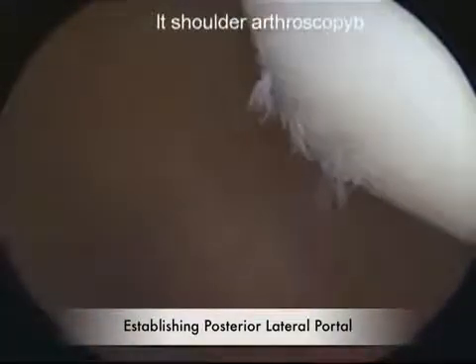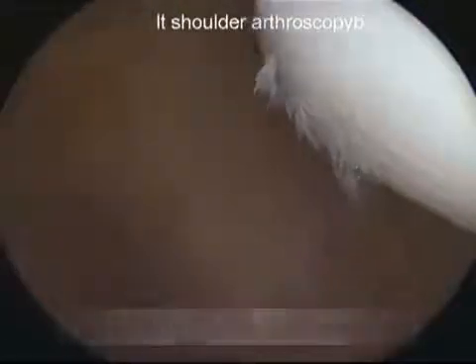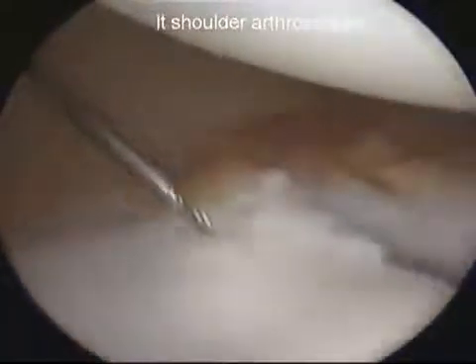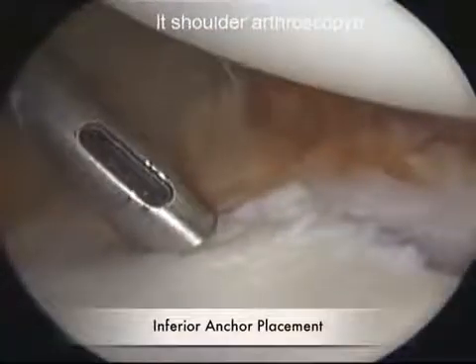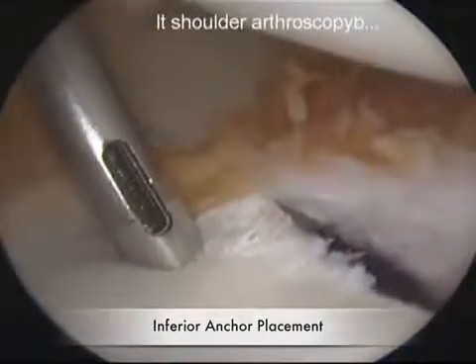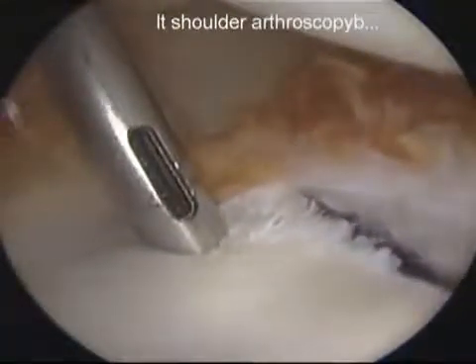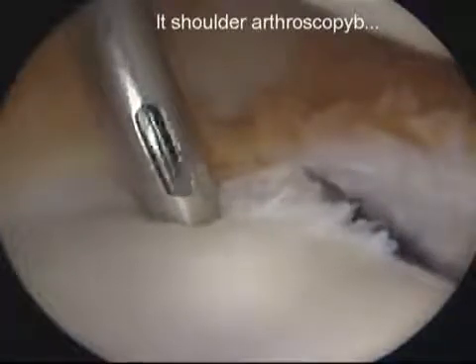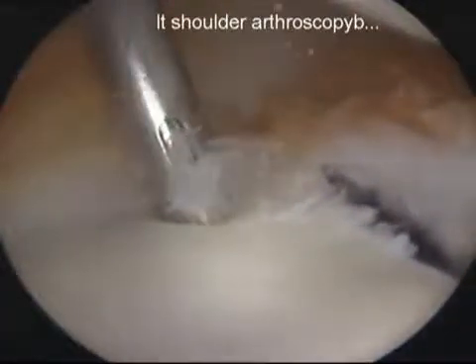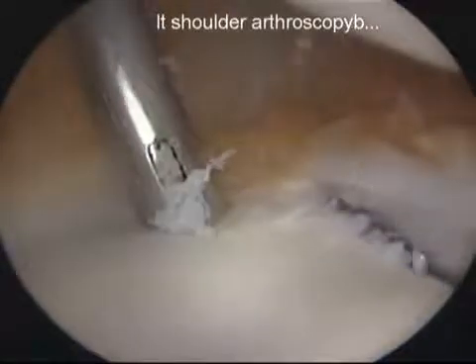The posterior lateral capsule is palpated in preparation for inferior anchor insertion. A spinal needle is again utilized to confirm adequate accessibility to the inferior glenoid. A percutaneous entry is established for the anchor guide. The guide is placed at the glenoid edge, taking care to optimize anchor placement. The appropriate angle is maintained and standard drilling and anchor insertion is carried out.